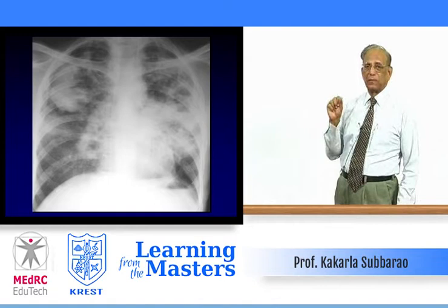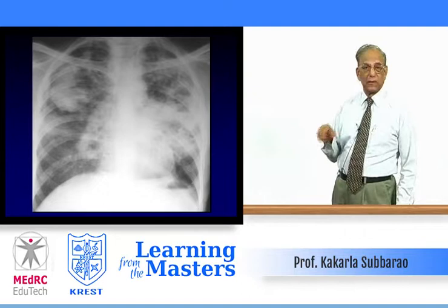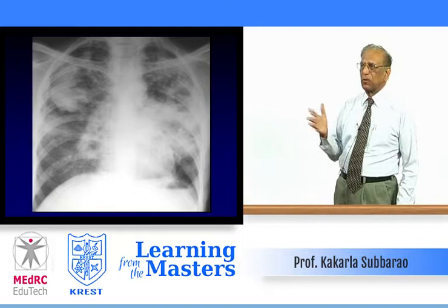The first thing we do is take a conventional radiograph of the chest. While observing the important points, don't go to the diagnosis immediately, although a classical diagnosis may strike you. Observe the findings: there are bilateral, patchy, homogenous opacities scattered in both lungs. Regarding the pleura, there is no pleural reaction.